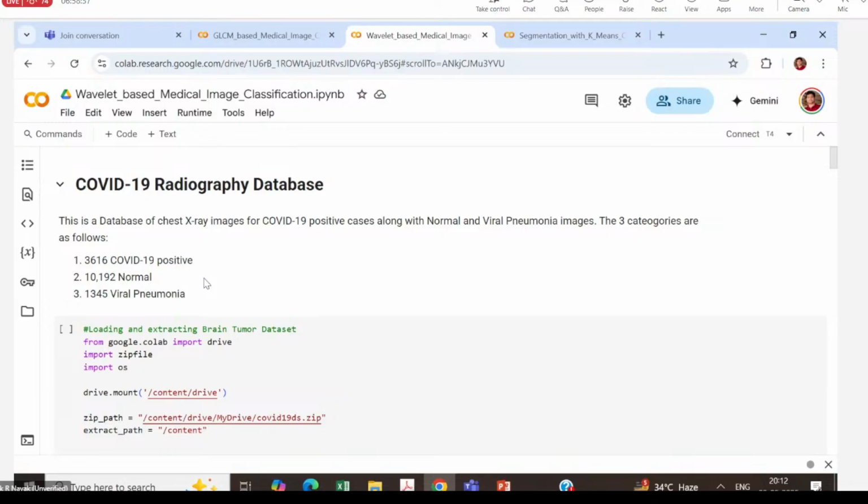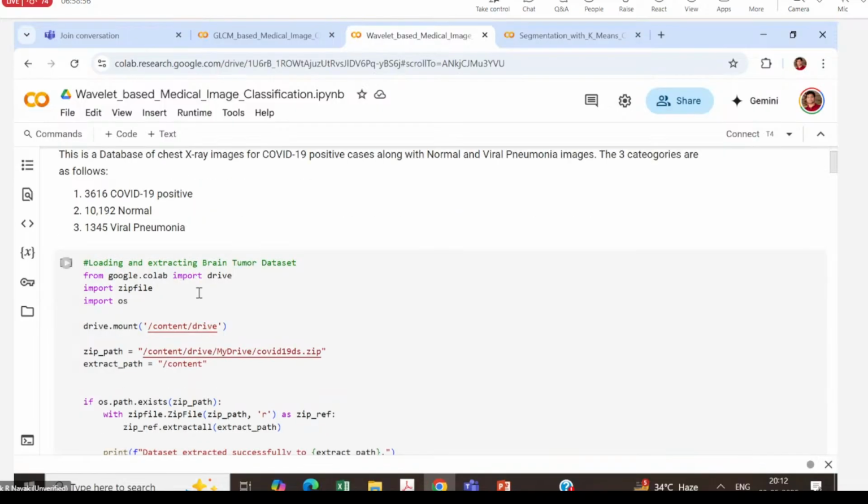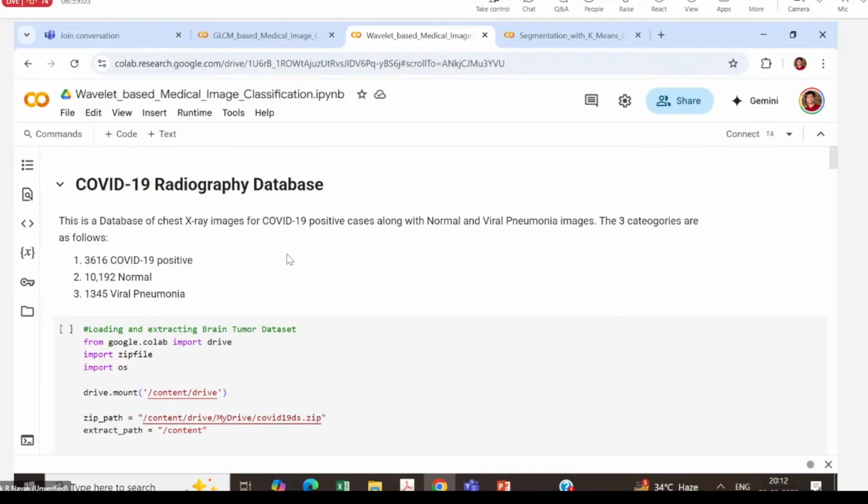I mean, every image can be subdivided into high frequency and low frequency components at different resolutions as well as at different scales, right? So basically you will get the features in 3 different directions: horizontal direction, vertical direction, and diagonal direction, right? I've shown you the picture after decomposing an image using a 2-dimensional discrete wavelet.